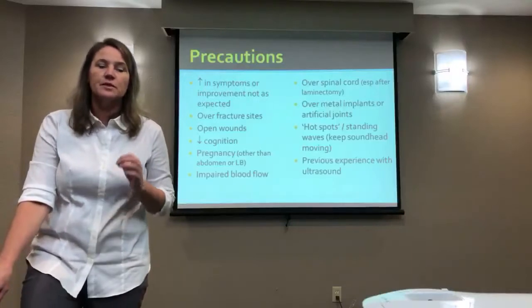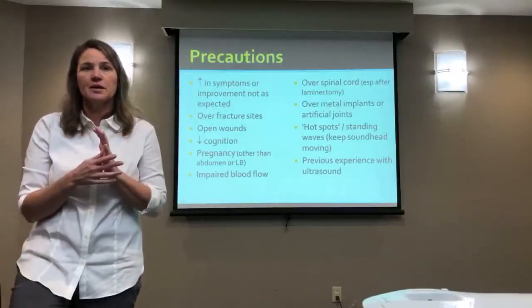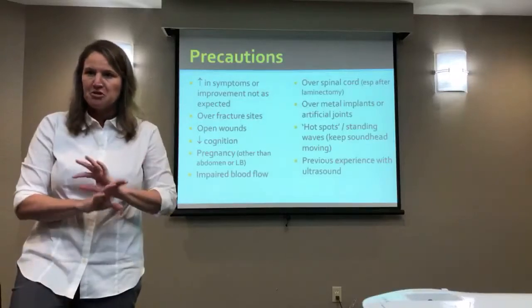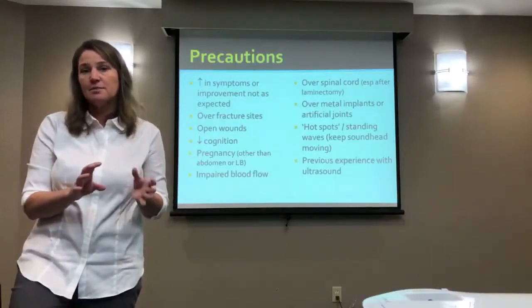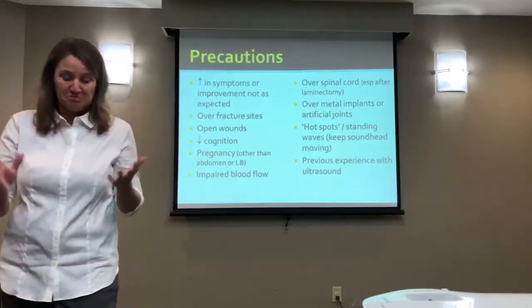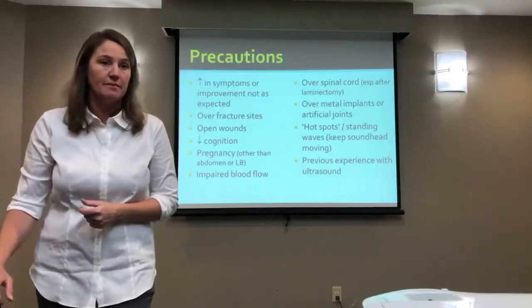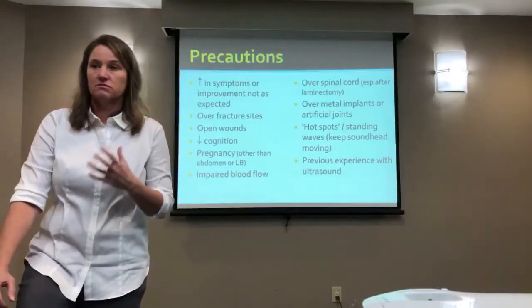If outcome improvement is not as expected, a good example in my mind would be, let's say you're trying to heat and stretch, increase range of motion, and this is someone who has a musculoskeletal problem, they're normal from a neuromuscular standpoint, and you do ultrasound. I would expect to see an improvement pretty much every time. It's not that complicated. I would expect that soft tissue to increase in range of motion every single time I treat them. Now let's say that that person is not neurologically intact.